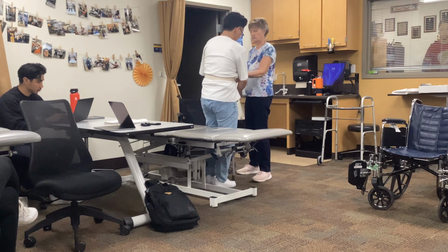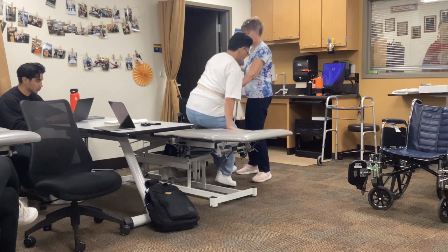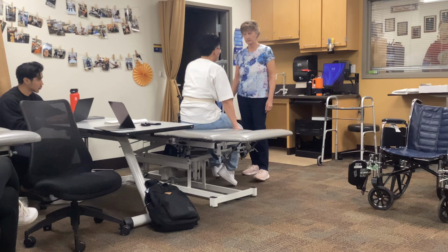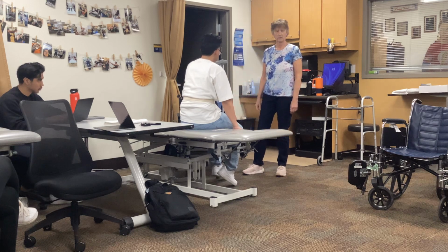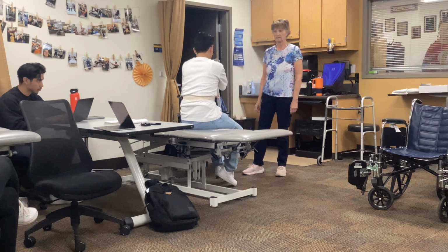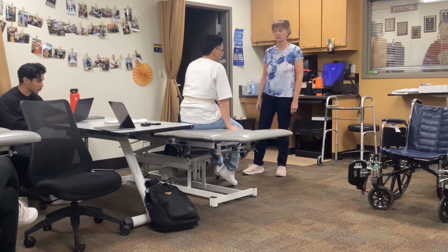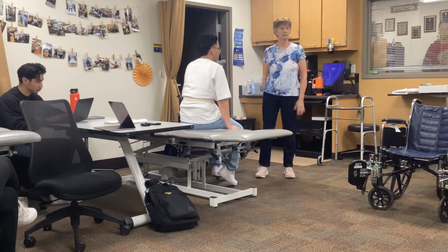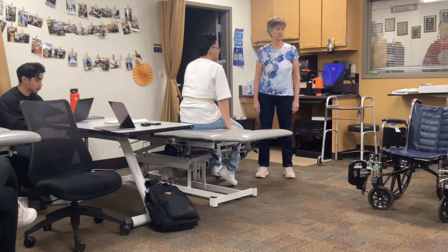Now what are you going to do? I would just say that gives you more leverage to put your hand on the inside rather than the outside. And then the same rules apply. If you were done, getting back up, move the chair to the other side so he can transfer to the stronger side.